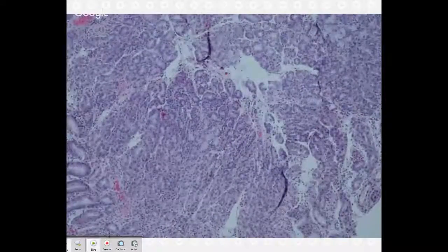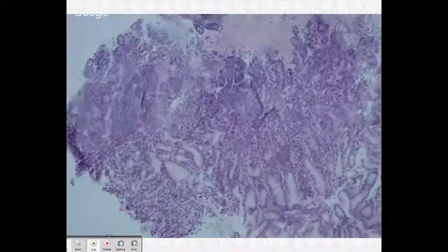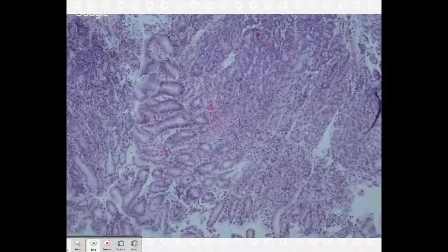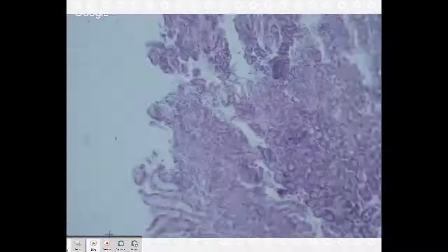And that is classic. Those ring form mitoses and the background apoptotic debris are classic for two types of medications. You were exactly right. So taxanes or Taxols. So those are chemotherapeutic drugs. And then your other one's going to be colchicine. So they both work the same way.